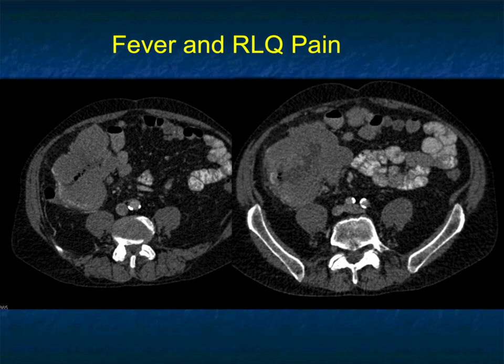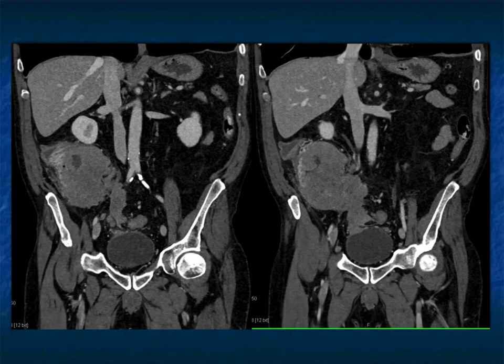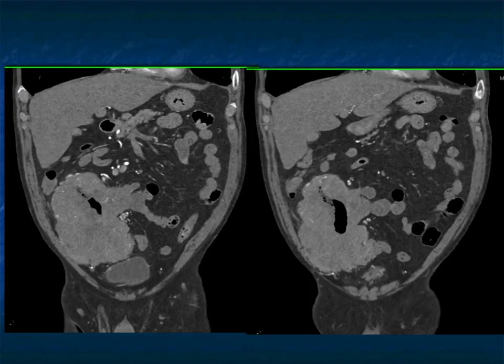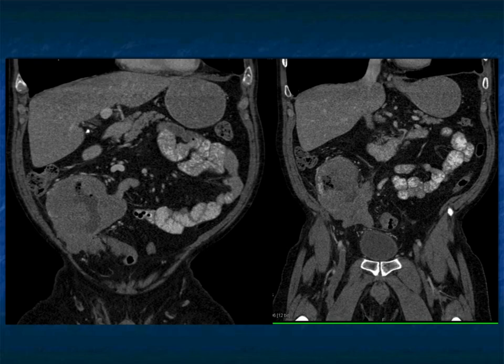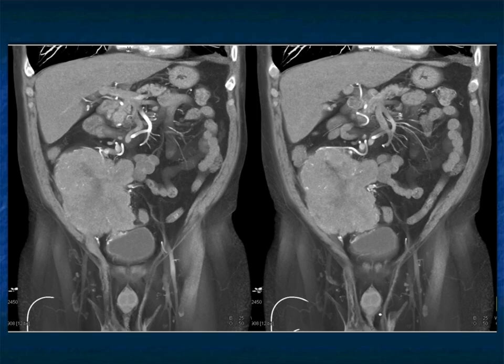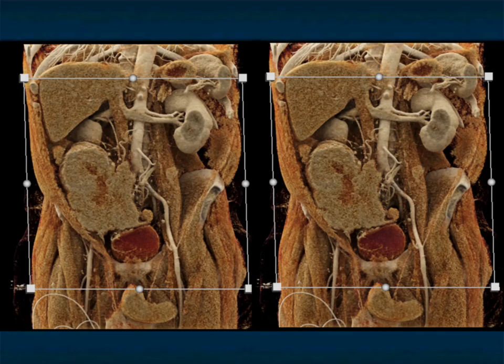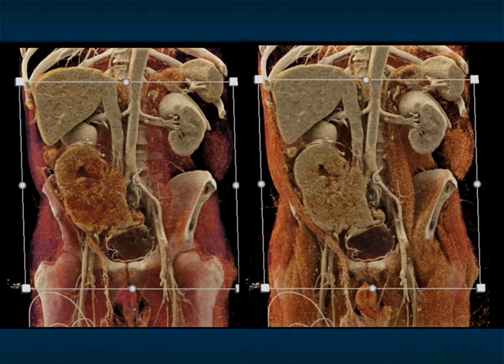Another example: a patient with right lower quadrant pain and fever, with a large bulky tumor that also appears to involve the ileum. The bulkiness, the lack of obstruction, and the ileal involvement make me think of lymphoma. Look at the bulky tumor infiltration in the right colon and the involvement of the ileum — a really beautiful example of primary lymphoma of the colon, nicely shown on both volume rendering and cinematic rendering.